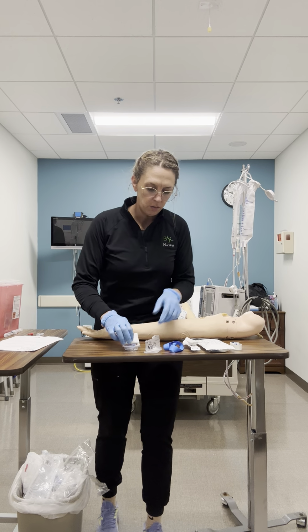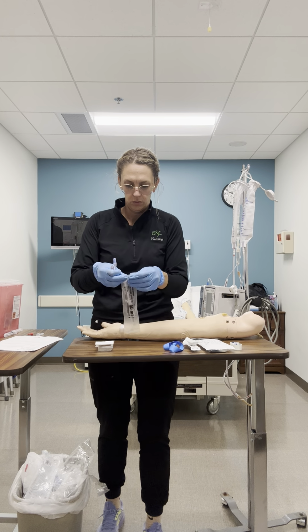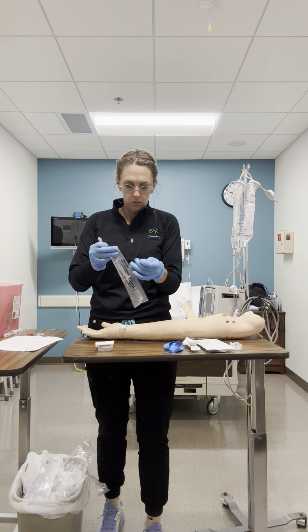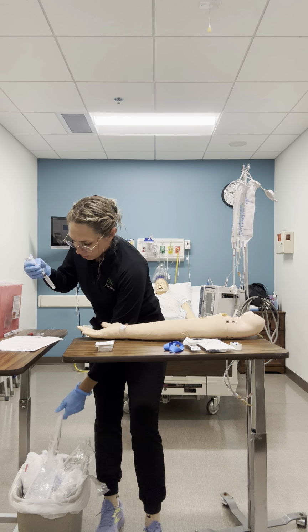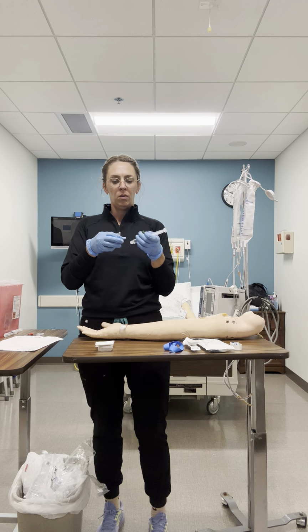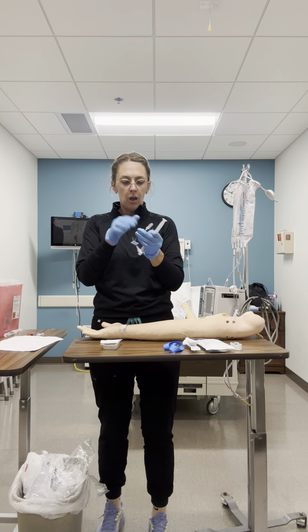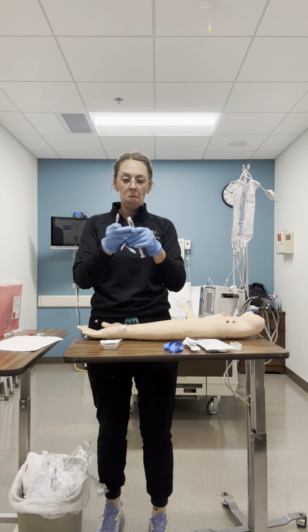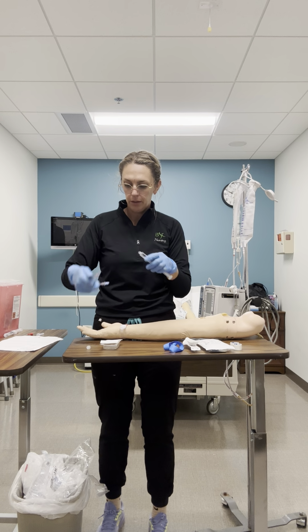Okay, so now I've got my short extension catheter and my saline. I'm gonna hook my short extension catheter up to my saline.